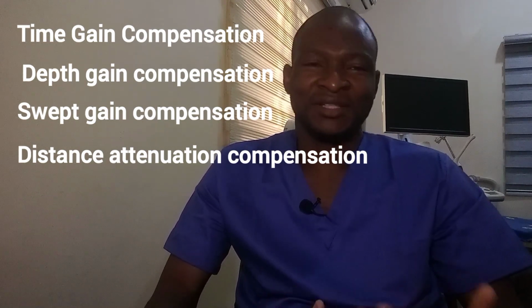Let's look at the objectives and the obstacles for TGC setting. The basic objective is to display identical reflectors to appear similar regardless of depth. But the obstacles: identical reflectors produce different echoes when they are located at different depths. The go-return distance that the pulse travels is different for identical reflectors at different depths.